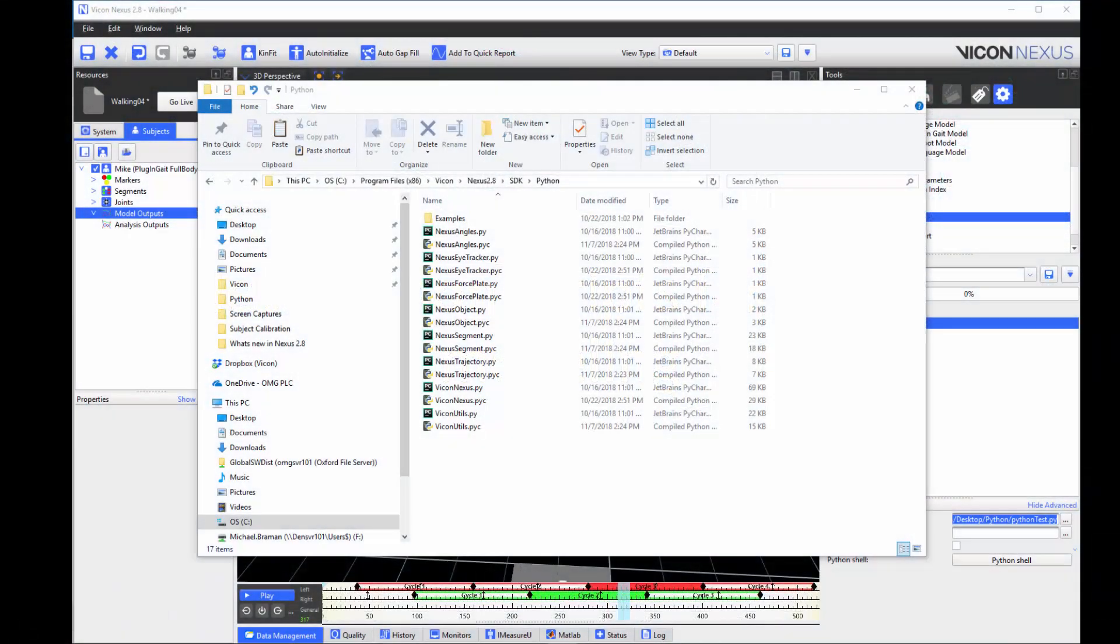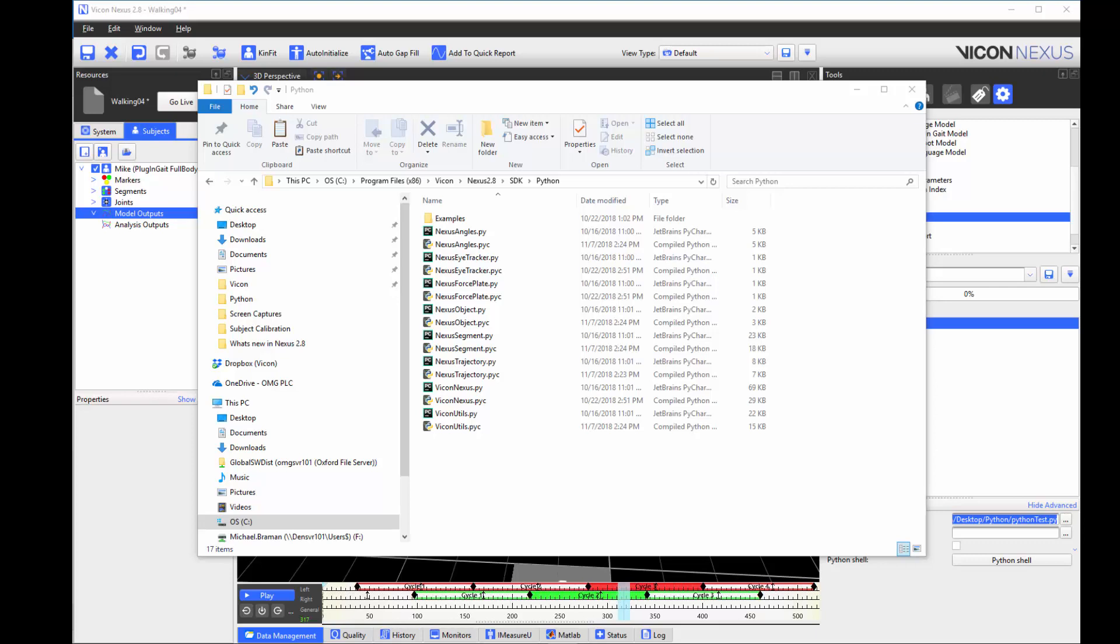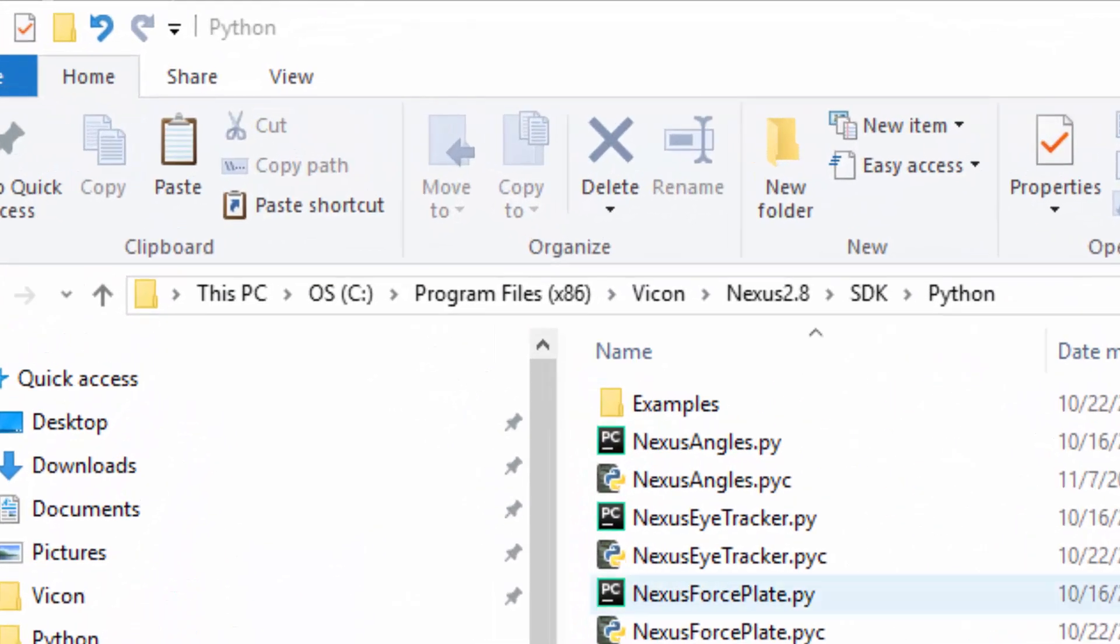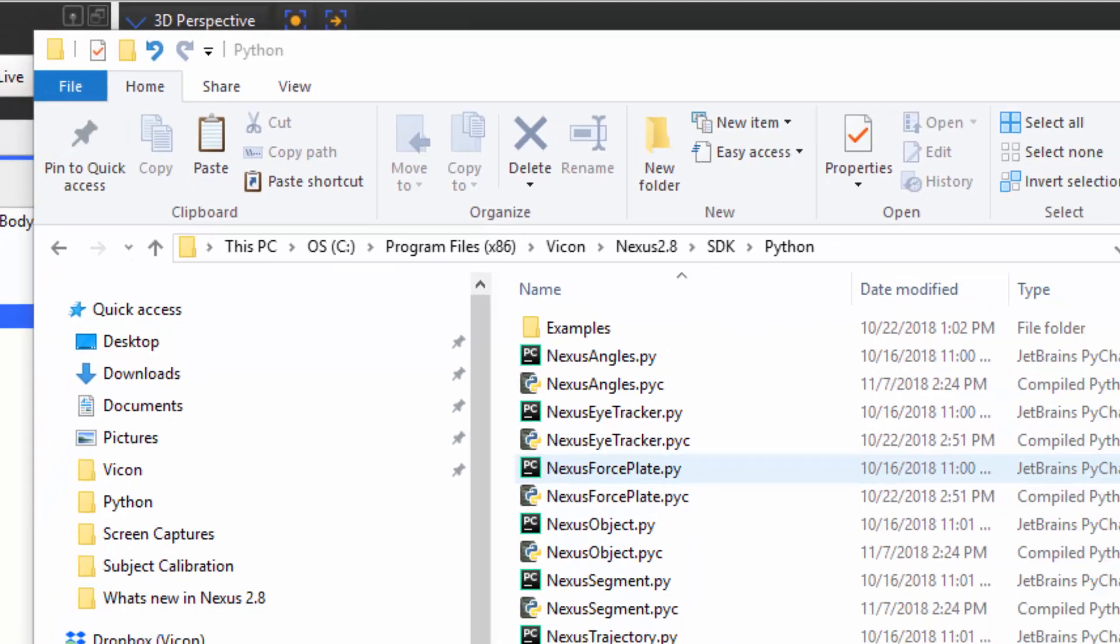Several additional Python scripts have been added to make it easier to develop models within Nexus. These Python scripts include Nexus Angles, Nexus Segment, and Nexus Trajectory. You can find these scripts at the following path. These functions are specific to Nexus 2.8. In the next version of Nexus, you will need to specify the appropriate path as functions may have been added or improved.